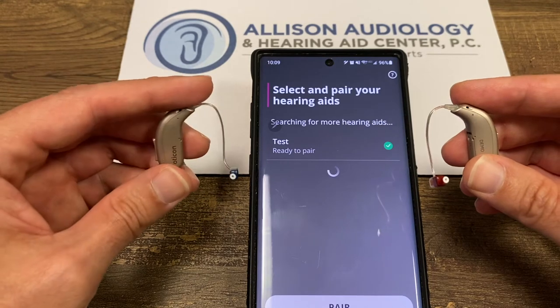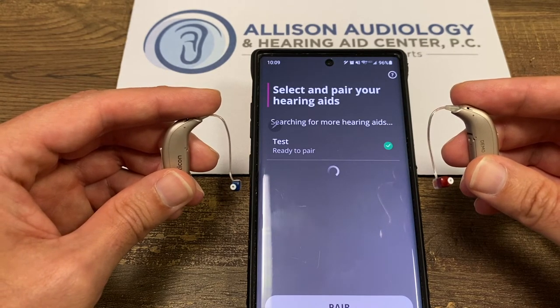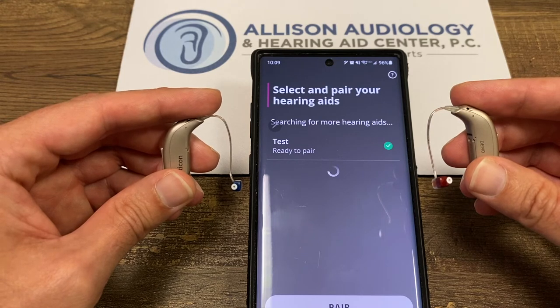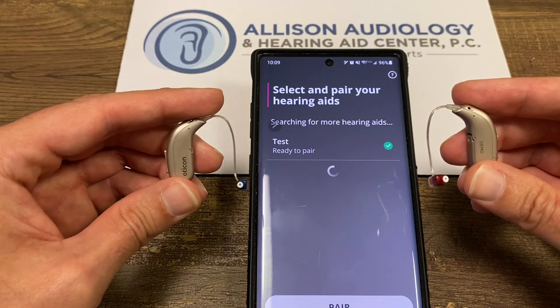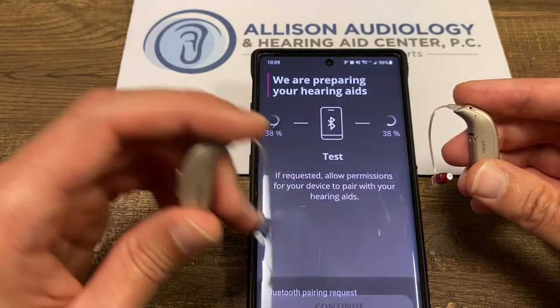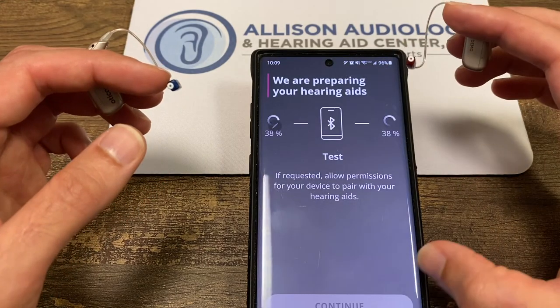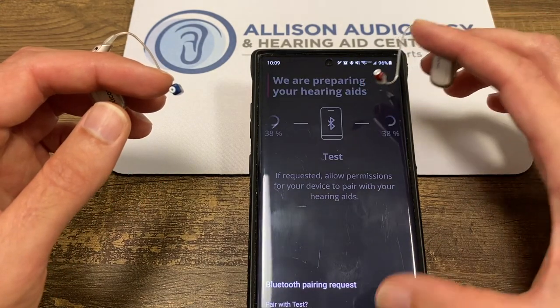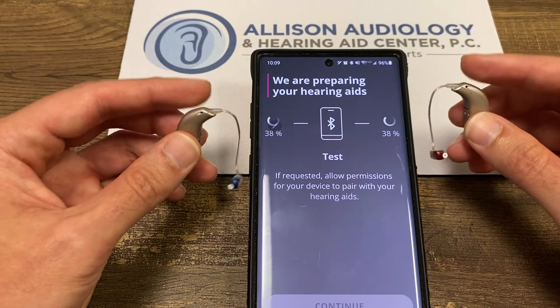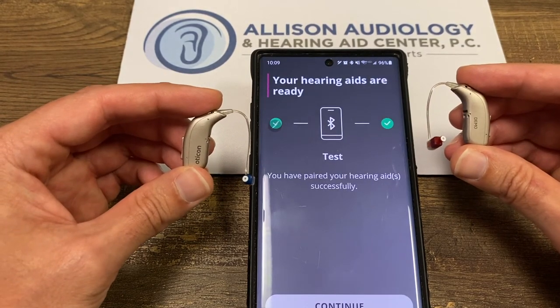It's looking for the second one. We're going to pair one, pair two. Download the settings and we're ready to go.